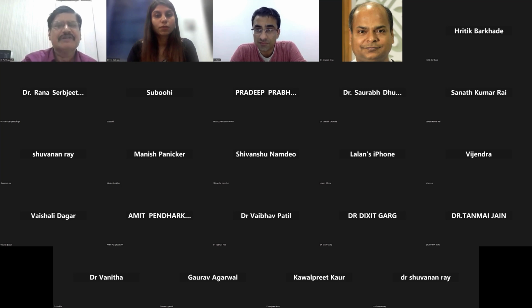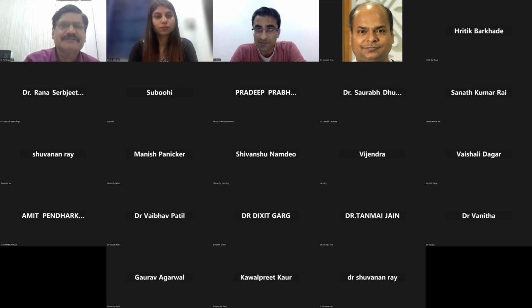Actually, in this given case, the calcium nodule is the OCT finding. This is my say, because we have seen plenty of cases like this, with recurrences. That's why even Dr. Akasaka and Dr. Gary Mintz said it is very, very difficult, as these calcific nodules present as chronic stable syndrome, unlike ACS, which is a soft nodule, compressible, with less recurrence compared to this one. So naturally you do not know, but this is the alternative approach. But anyway, you got a very good result in this given case.